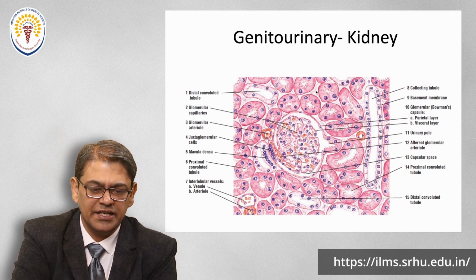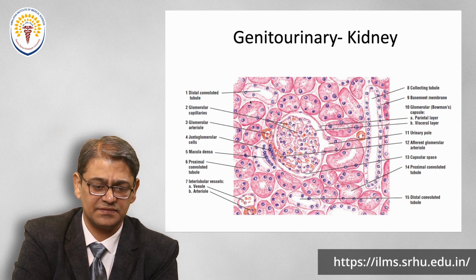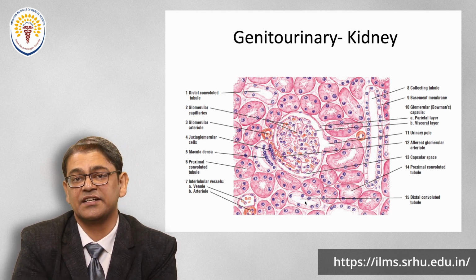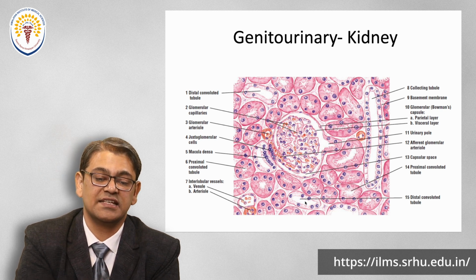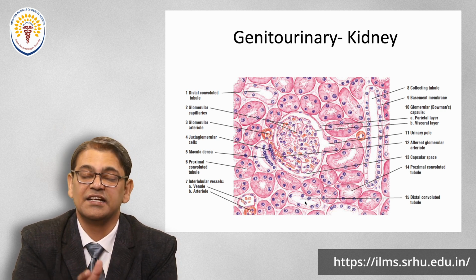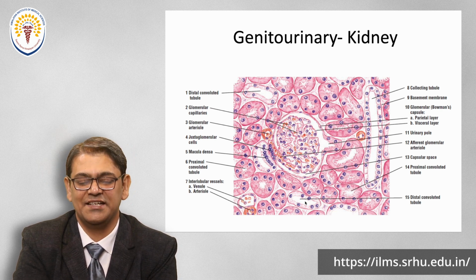In between here, what could it be filled with? Any guess? Yes, you are right. It is filled up of connective tissue. In earlier lectures I have told you that connective tissue is a binding or filling material. You can see both things here: it is binding all these tubular structures together, and also filling it. That's how you can visualize the beautiful function of the connective tissues over here.